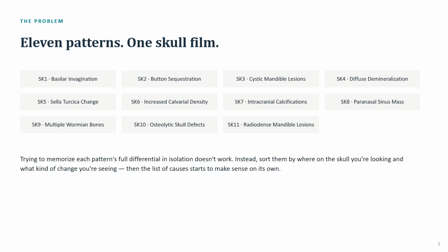Again, we're not trying to memorize any of these, but we are looking for the patterns. We're trying to look for where the patterns are occurring in the skull, and we're also going to briefly look at the kinds of changes that we'll see and also what causes those changes.